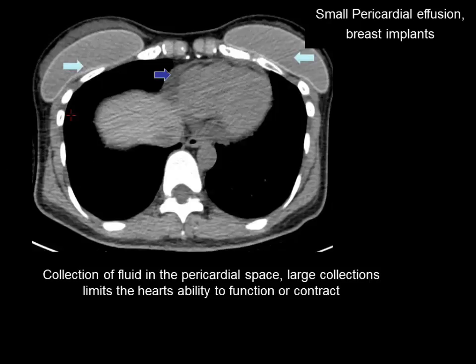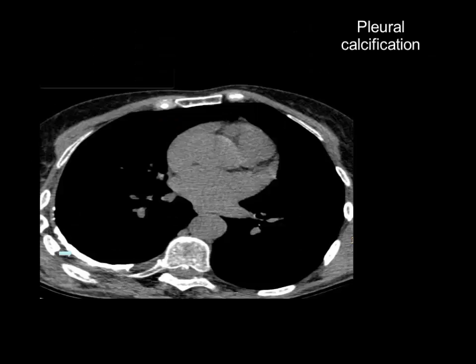Small pericardial effusion — with breast implants, this is a collection of fluid in the pericardial space. Only large collections will be a problem; with smaller ones it is better to mention, but it may not have clinical relevance. Pleural calcification — when you see it, it is better to document and report. Unless you look for all these conditions, you are not going to find them.